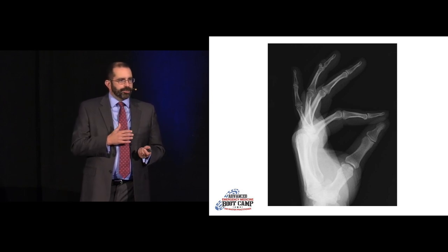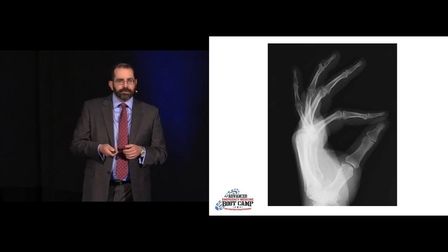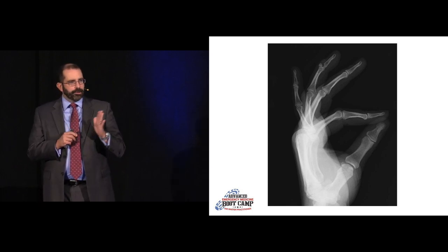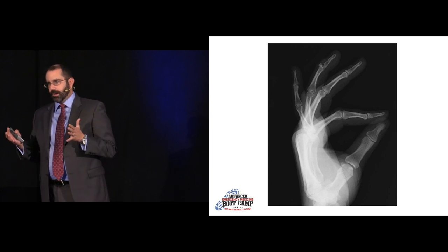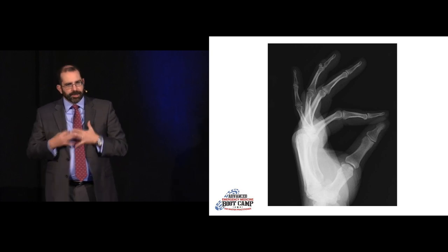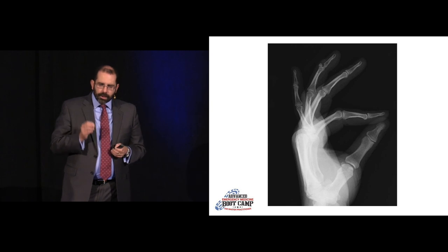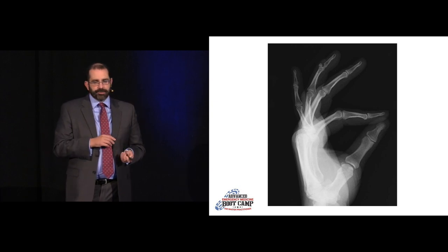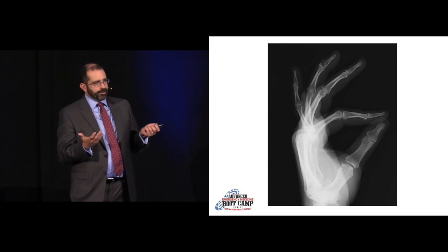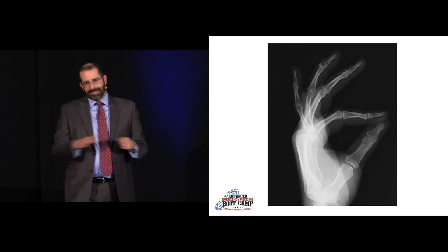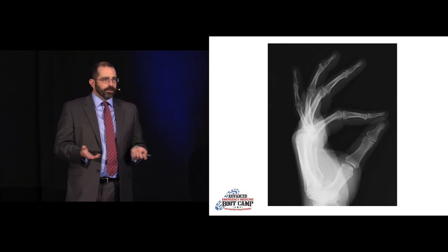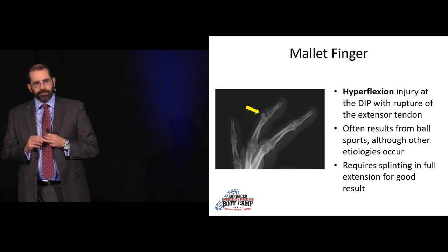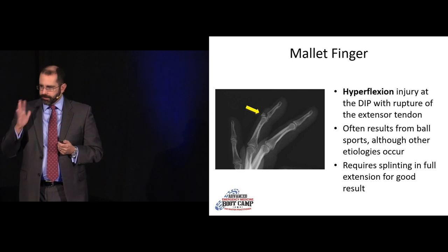This kid comes in with finger pain playing basketball. On the lateral, it's almost the exact opposite of jersey finger — there's a little avulsion on the extensor side of the DIP. This is a mallet finger, occurring with forced flexion of a finger held in extension — common in ball sports when you take a bad snap. These are extensor tendon injuries often managed non-operatively with splinting for eight to twelve weeks. If you move it at any time during that period, it resets the clock and may require operative repair.